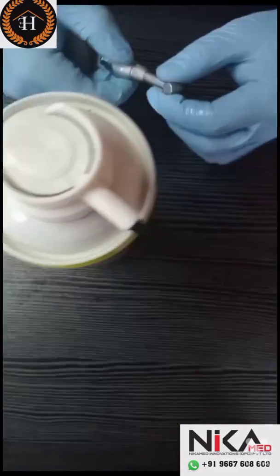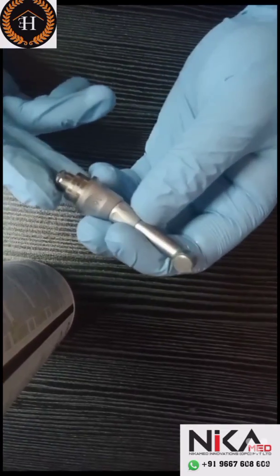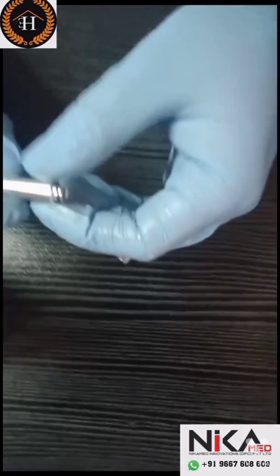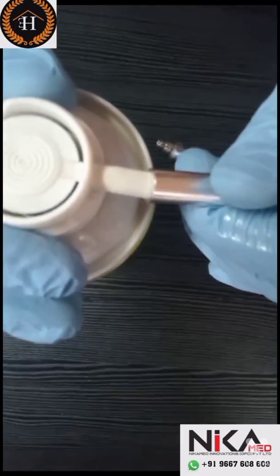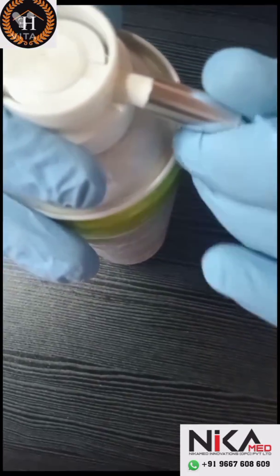Now we are going to demonstrate how to lubricate the endomotor handpiece. This is an X-smart contra-angle handpiece. We have to choose the correct nozzle first. This is an F-type nozzle with O-ring with an internal thread to prevent leakage. Fix the nozzle on the oil bottle and push and rotate clockwise 2-3 times.